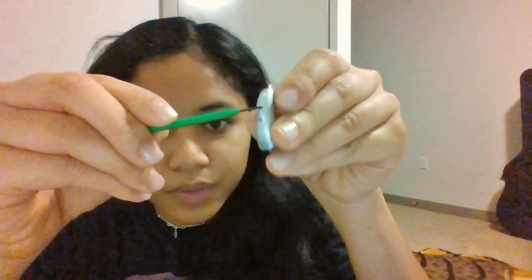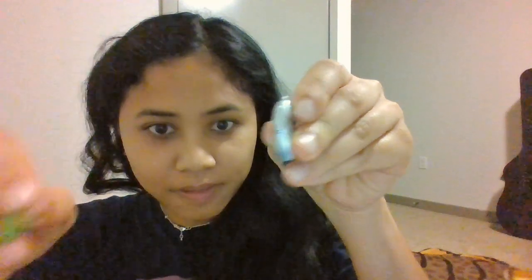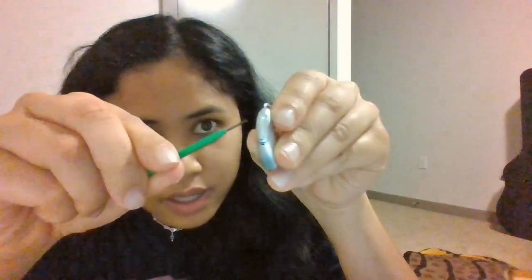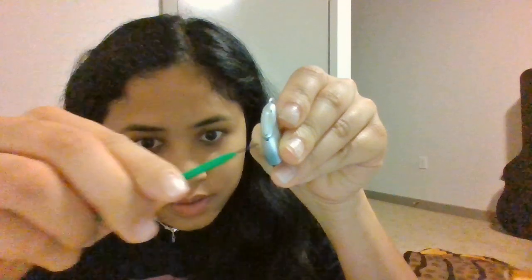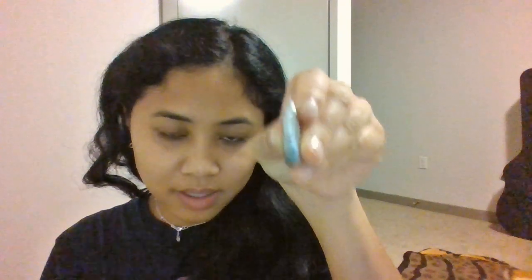Right over here you've got your volume button. Then you've got three holes right here, and those are your microphones — picking up the sounds that you need. Every now and then, debris might get in, so it's good practice to clean them even if you can't see anything in them.